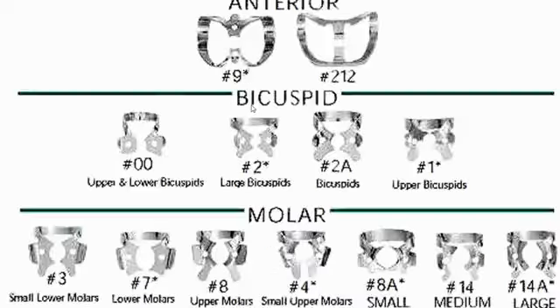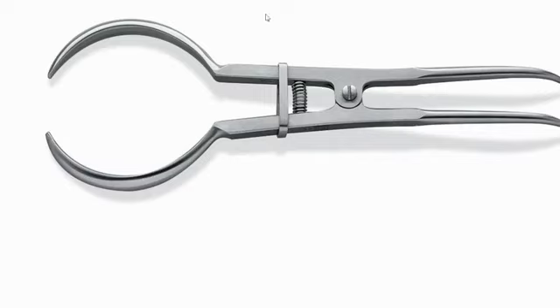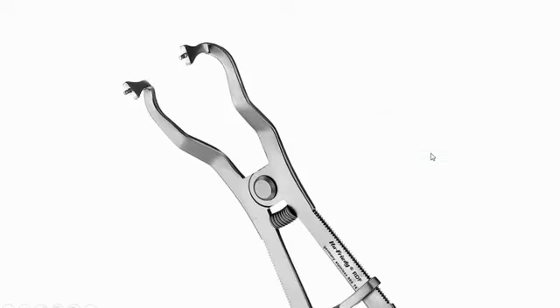Just remember कि जो forceps है आपके होल्स में एंगेज होके क्लैम्प्स को आपके टूथ पे प्लेस करने में हेल्प करेगी, and this is the thing which will be there. When you press, it opens up and you can lock it so that it doesn't close. ठीक है? I think this component is also very much clear.